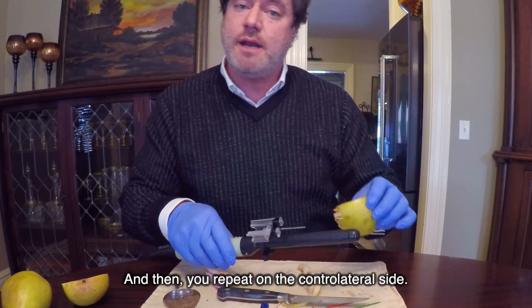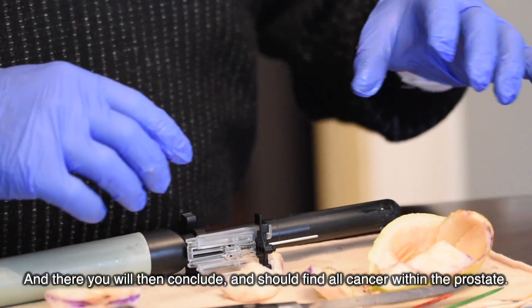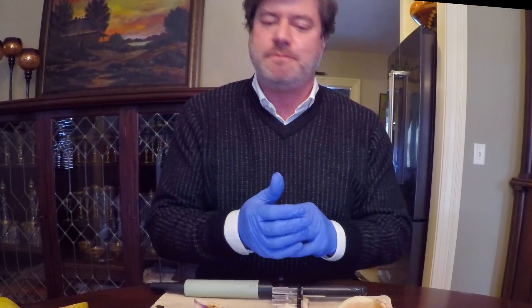You then repeat on the contralateral side, and you will have included and should find all cancer within the prostate. Thank you.